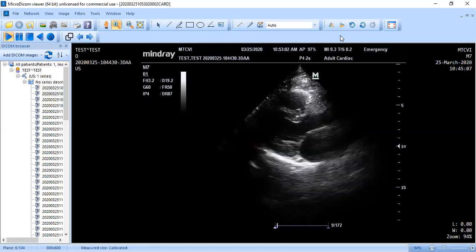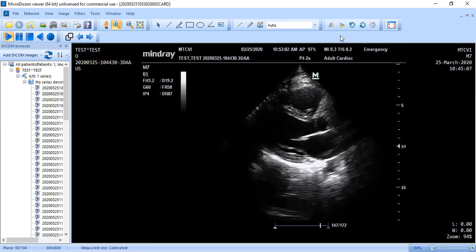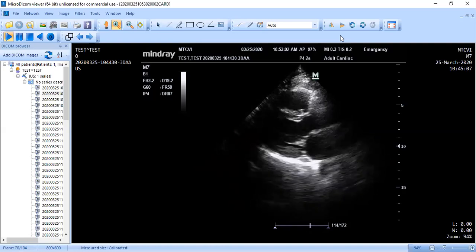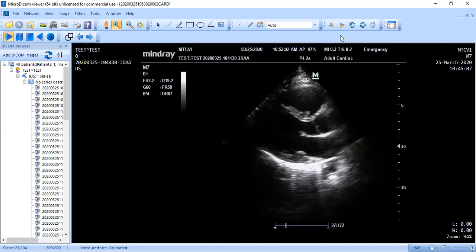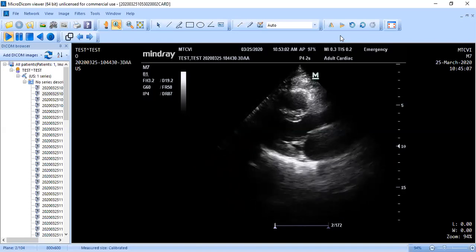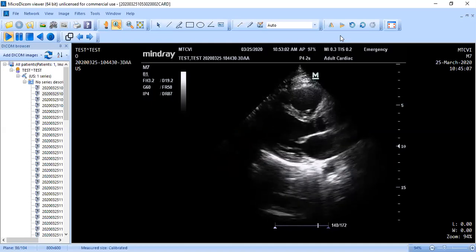If you want to go ahead and pull out the protocol that I gave to you. As I said to all of you, I uploaded another protocol into Schoology that starts the parasternal short axis at the base instead of the apex. The one you had previously started at the apex, so I reconfigured that to start at the base, which is what we've been teaching you all during this class. So here we go, starting out.